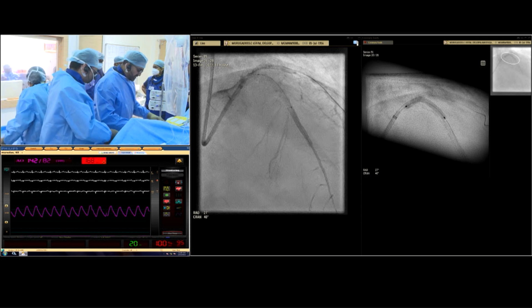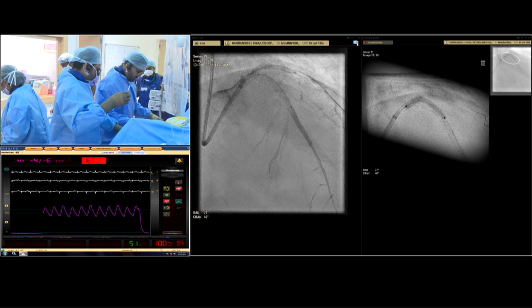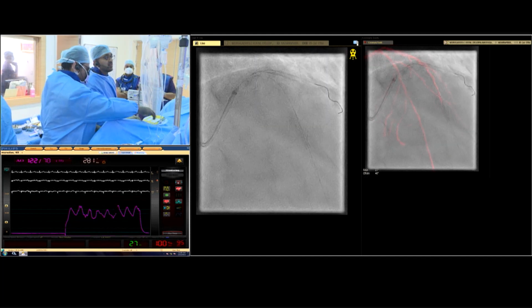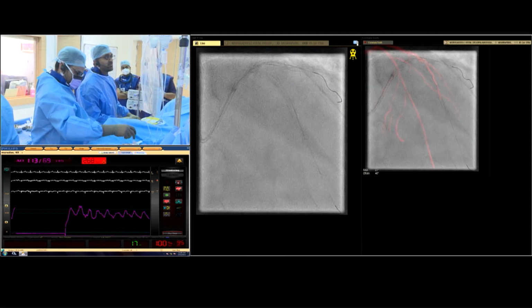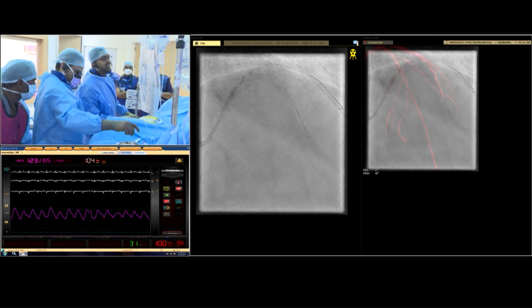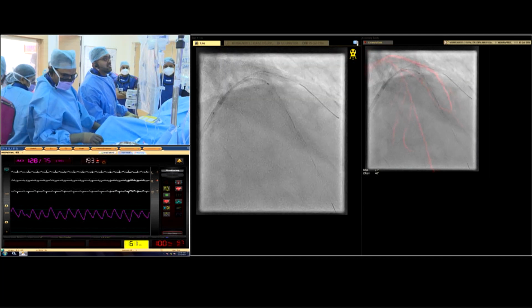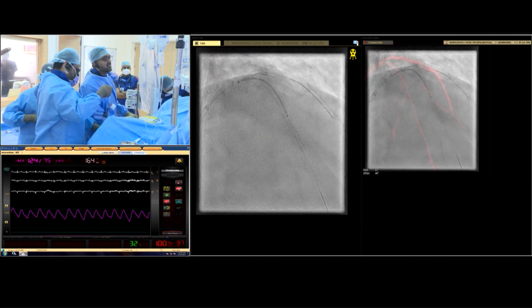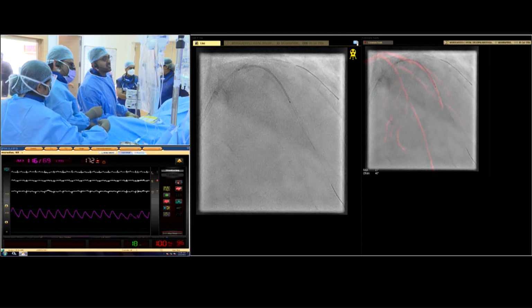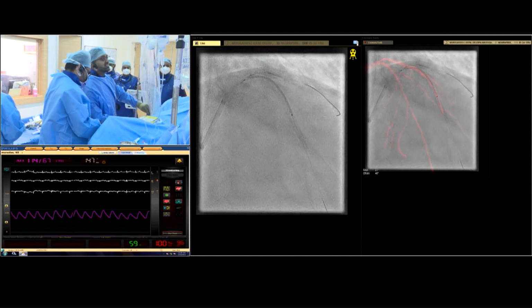How am I in terms of timing? Anand, you have to tell us. We were okay to crack on as we are because we were expecting a few less steps, but it became more steps for this case. I was so hoping it will be a provisional. That was my intention. I think 34, we couldn't have afforded to take anything less. I think you are absolutely right, and thank you. Makes a big difference getting all these inputs.